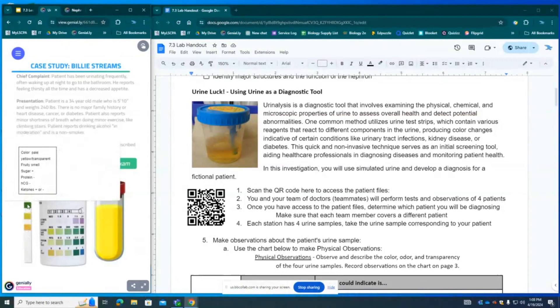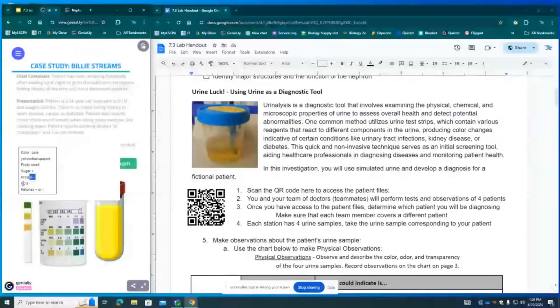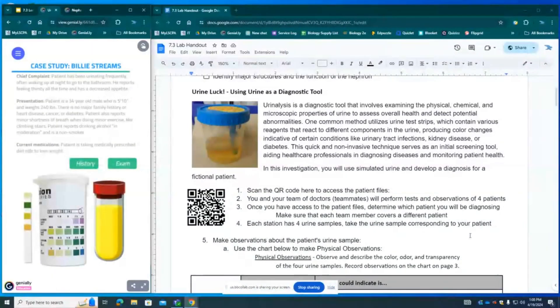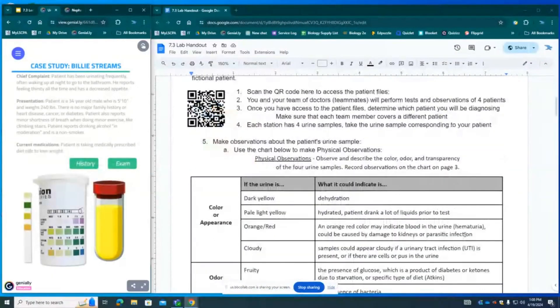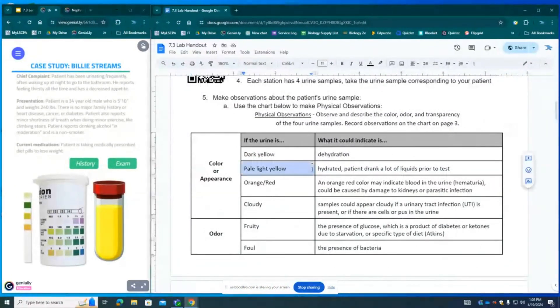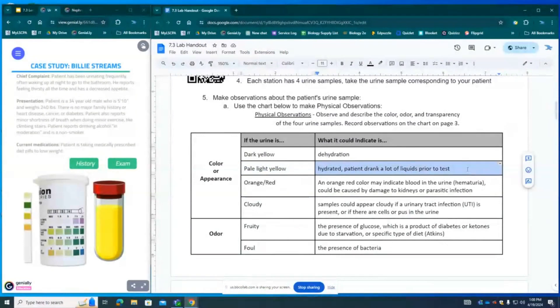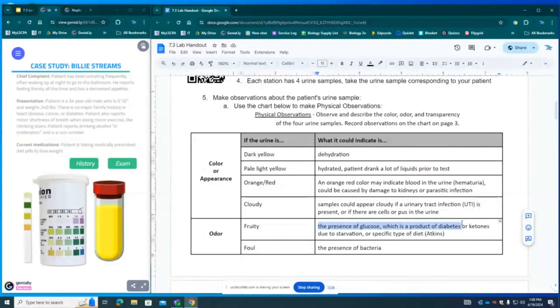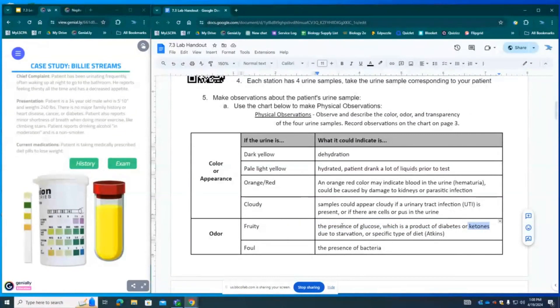If we compare the urine test strip colors to the chart we can see that they tested positive for glucose, negative for protein, and negative for ketones. So we're going to be observing this urine and interpreting the results based on this chart. If there is a pale yellow color this person is extremely hydrated or even overly hydrated. If the odor is fruity it may indicate the presence of glucose which is a product of diabetes. If it's only slightly sweet there may be ketones present but a very strong fruity smell indicates glucose or sugar.